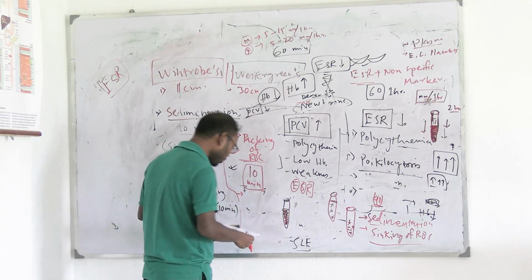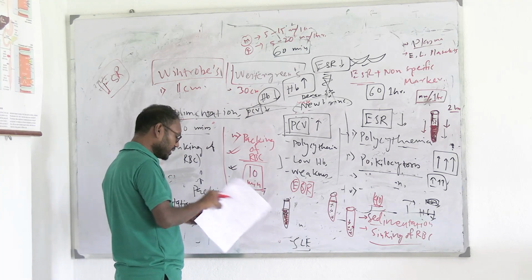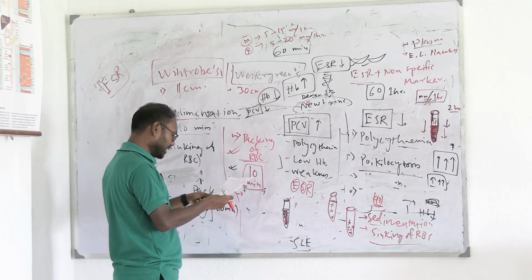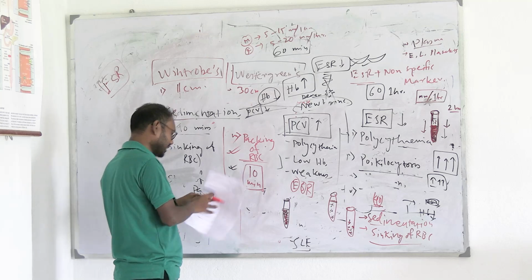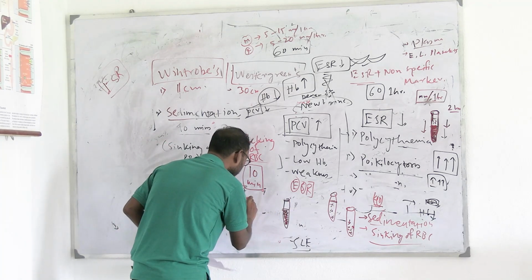Okay, and also this packing of RBC, this process actually has another name. Now, this process is also called stabilization.